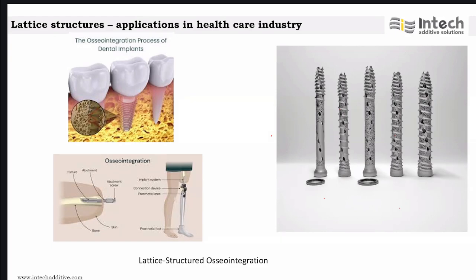Porosity levels have been varied, and thread geometry optimization has also been done. There are some profiles that are parallel and tapered. So those kinds of studies have been done.